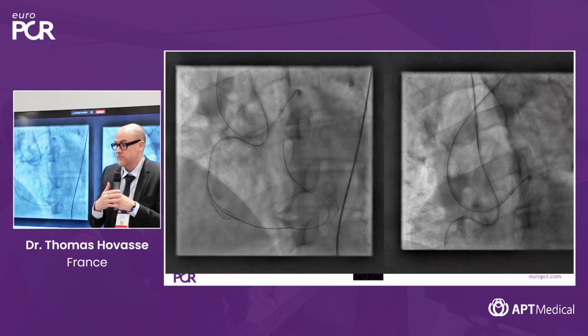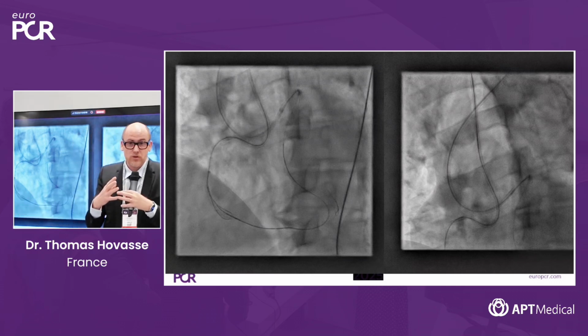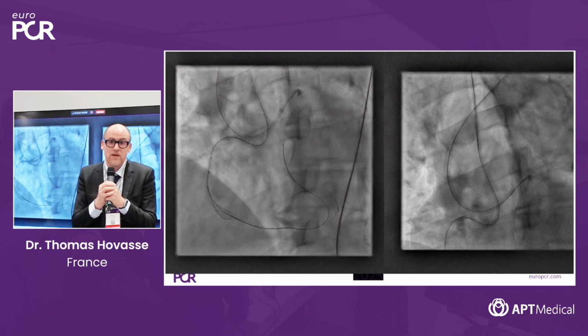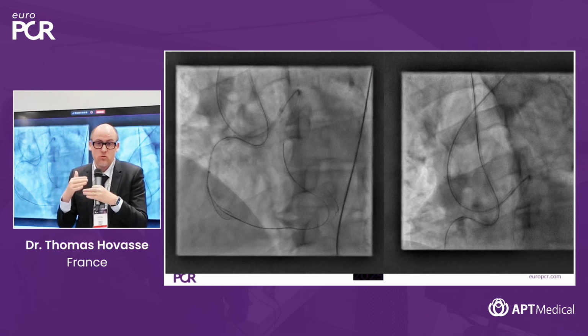But I will use at least a 3.3 balloon. 3.5, sure. And the purpose of the reverse CART is to break the walls between the two wires, whether they are subintimal, intraplaque, or anything. So if you take a too small balloon, like 2.5, it will be very difficult to break all the walls between the two wires.